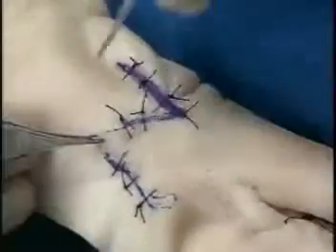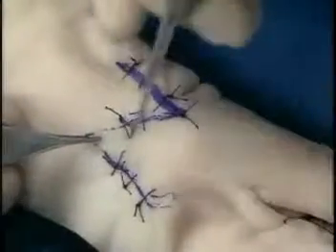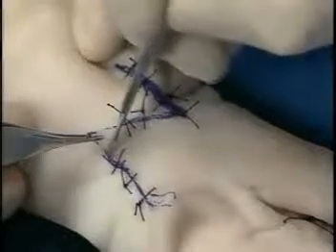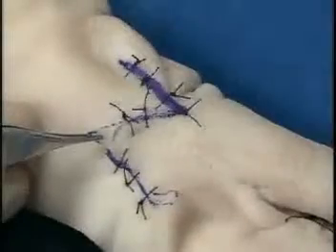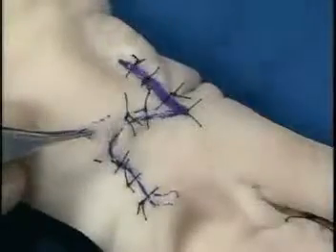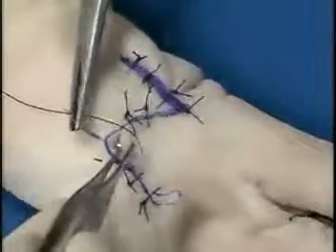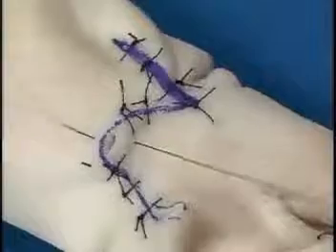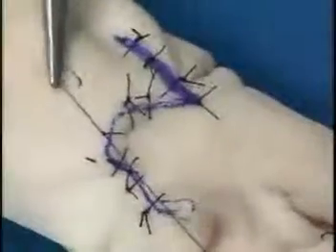Now we can see that there is this excess. We now will cut this triangular excess off so that the flap will inset nicely into the region of the defect. This can be trimmed off with either a pair of scissors or with a 15 blade. And now the final stitch is put into position to close the wound, and the flap is now nicely in position, closing the defect. Here we have the dog ear.